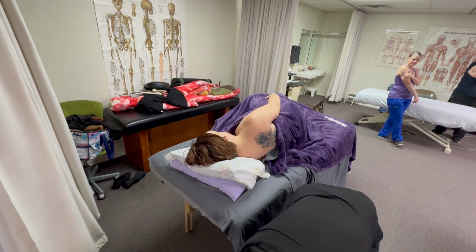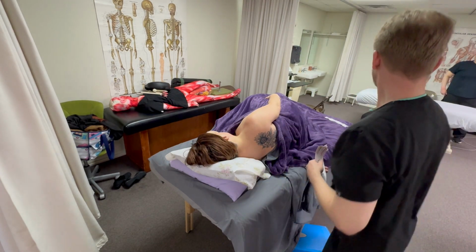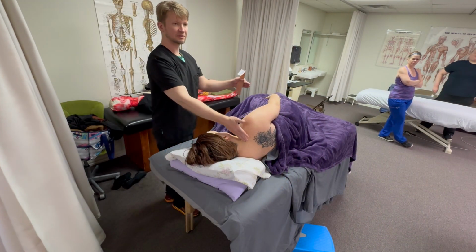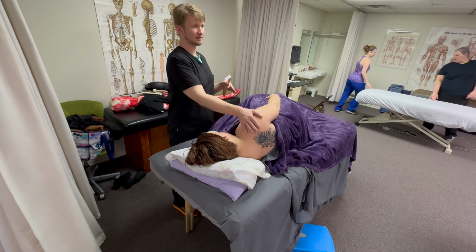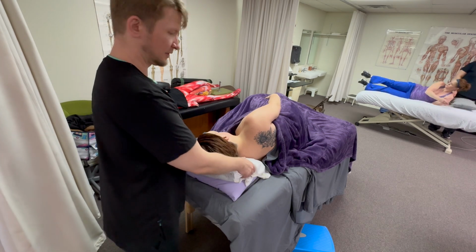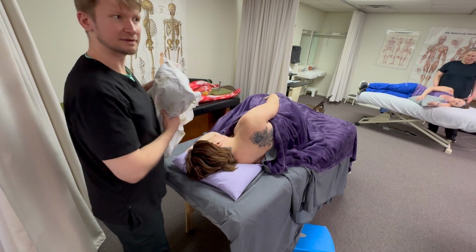All right. Tripping hazard. No. All right. Where my tape is, I pre-tore some anchors. We already have her in an ideal position where the arm is adducted, so this is already on some tension. If I wanted to increase the tension of the skin here, all I have to do is take out one of these pillows. So we're going to take one pillow out, nice and slow, down. Now we have that a bit more lengthened.